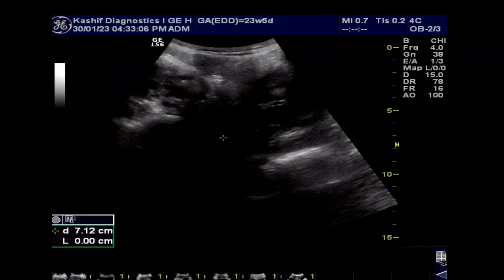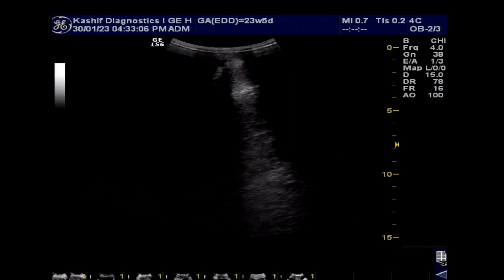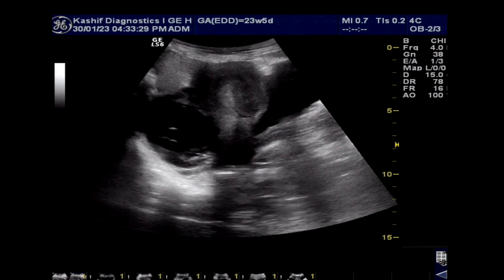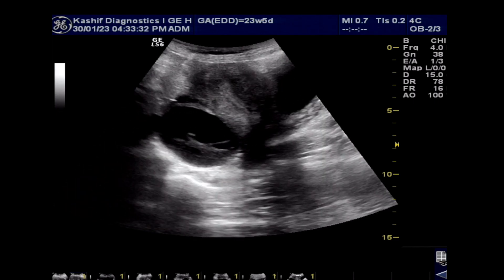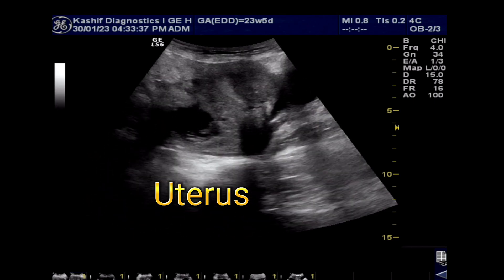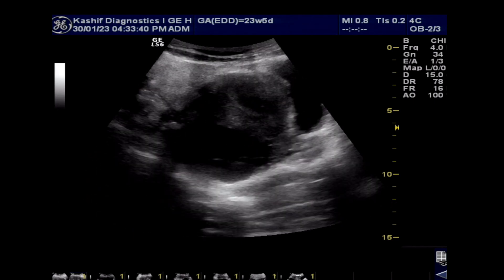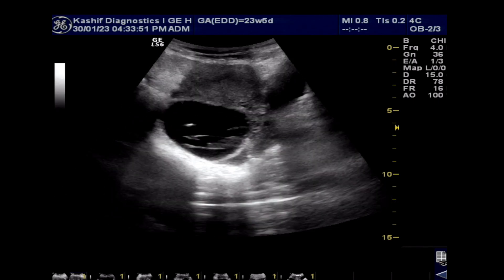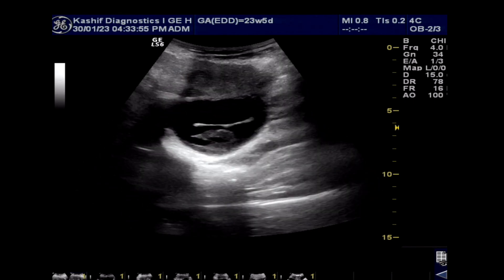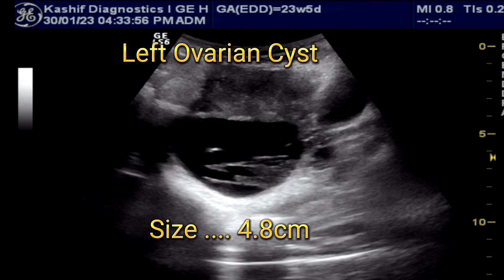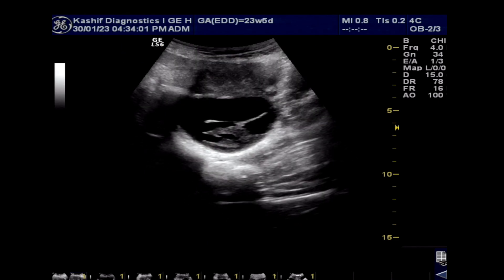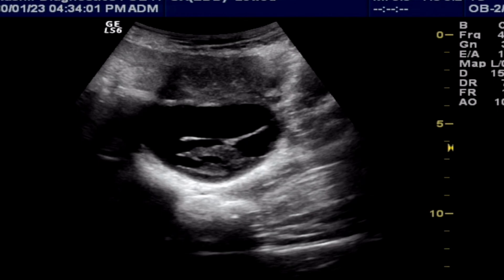This is a scan of a woman, 25 years old, with pain in the pelvis. The uterus of the patient is normal; there is no free fluid in the pelvis. The left ovary shows a cyst with thin walls, fine internal strands, and some hyperechoic areas. No intracystic blood flow is seen. This is a hemorrhagic ovarian cyst — a bleed in a functional ovarian cyst.